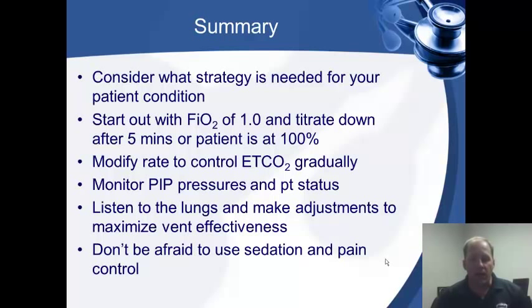Last but not least, don't be afraid to use sedation and pain control. These things help your patient be more compliant with the vent, they prevent overbreathing or bucking the vent, and they help your patient get better faster. If they're really tired from trying to deal with their CHF or COPD for a couple of days, they're probably going to be really tired. They can use that little bit of a break.